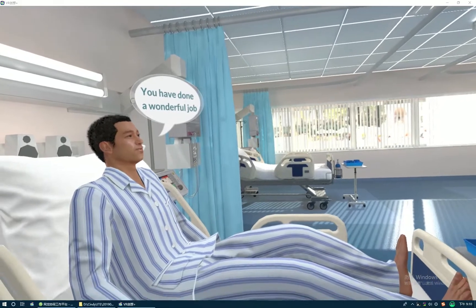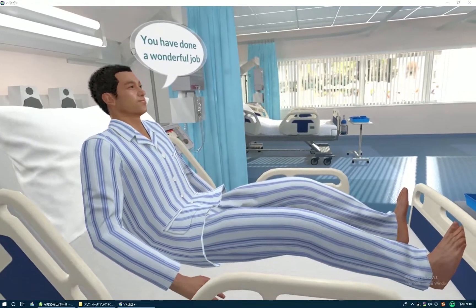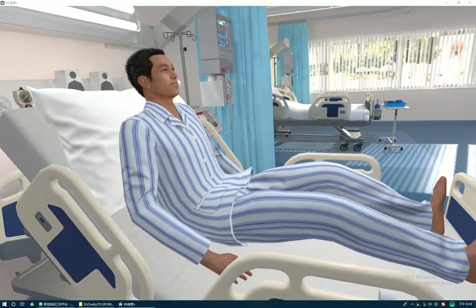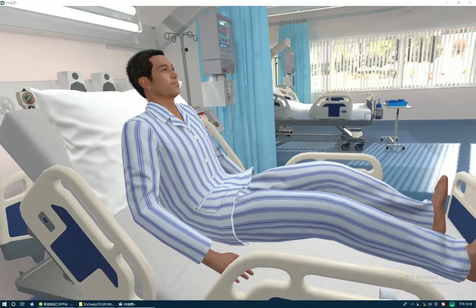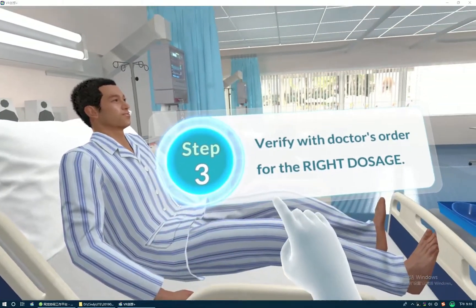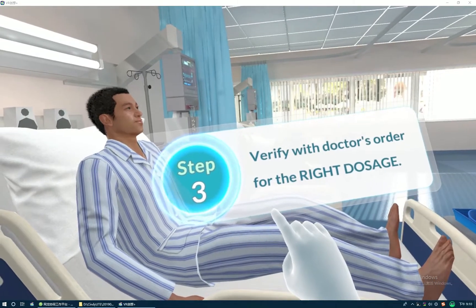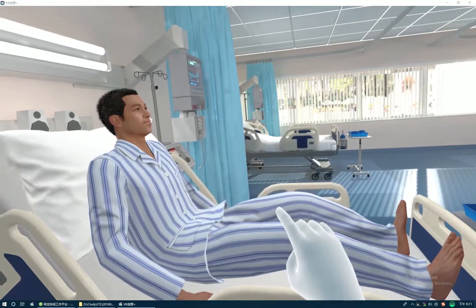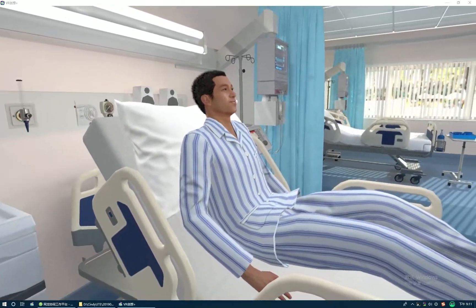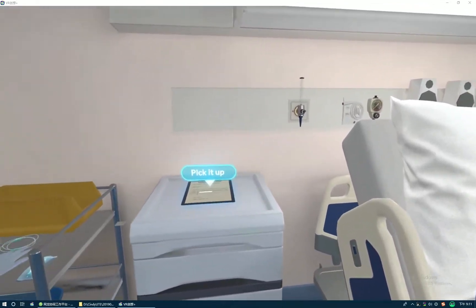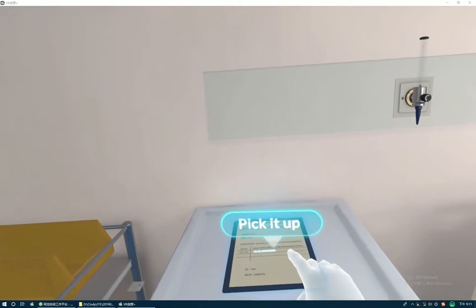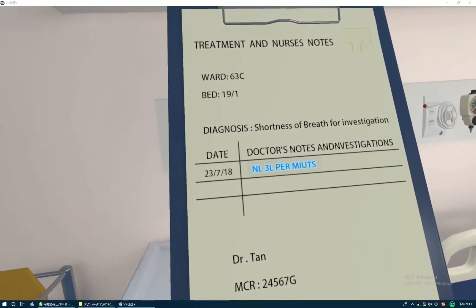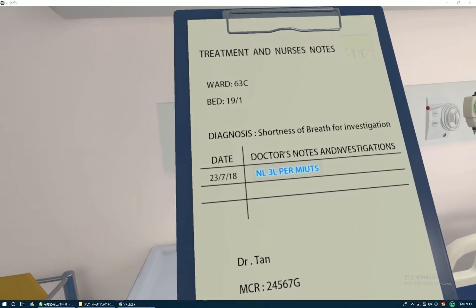You have done a wonderful job. Now you are ready to move to the next step. Verify with the doctor's order for the right dosage. Turn on the flow meter to the prescribed rate. This is to prevent medication error.